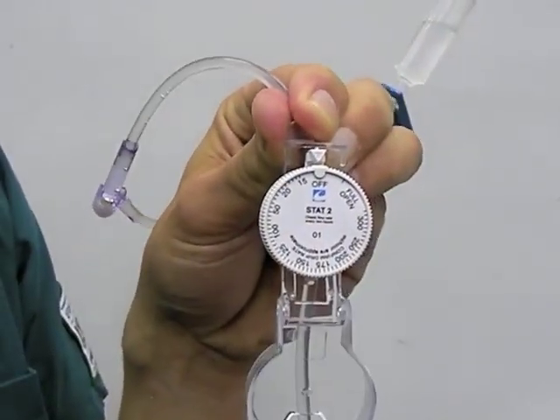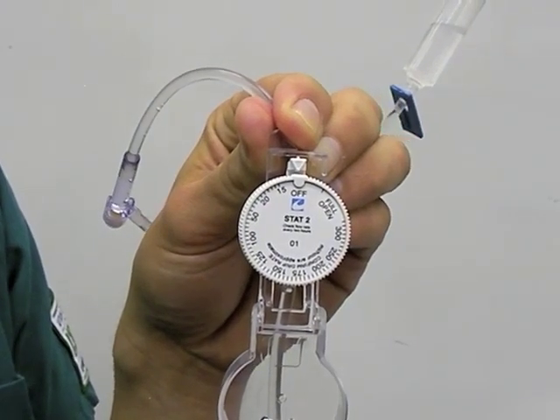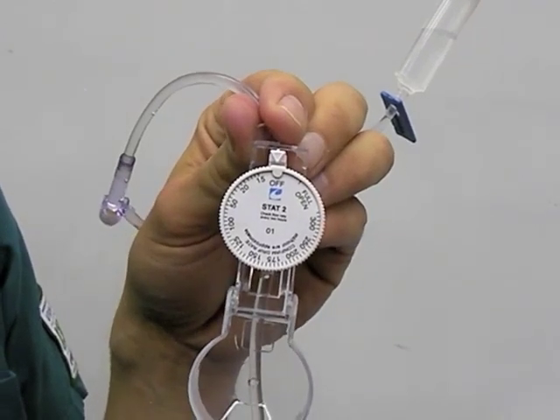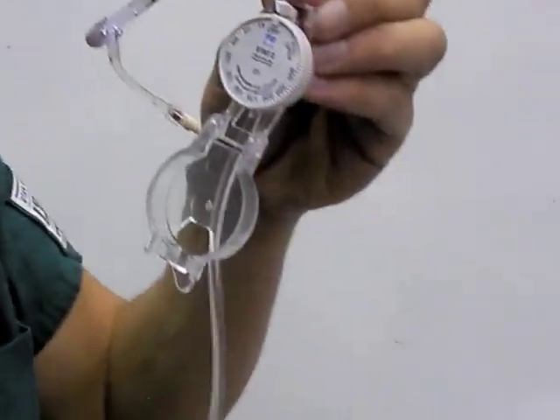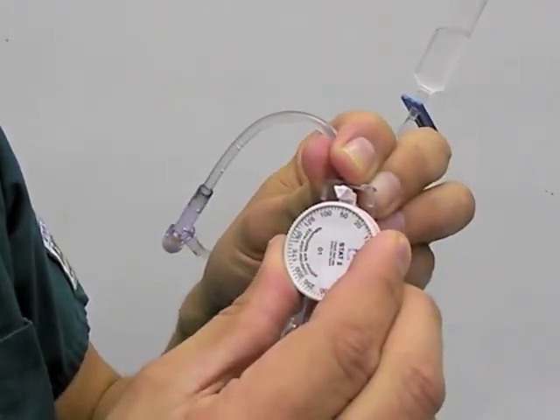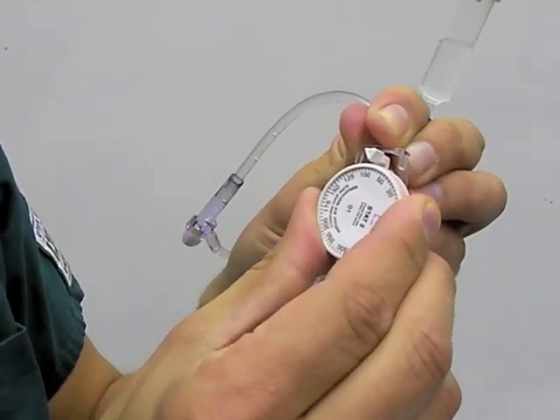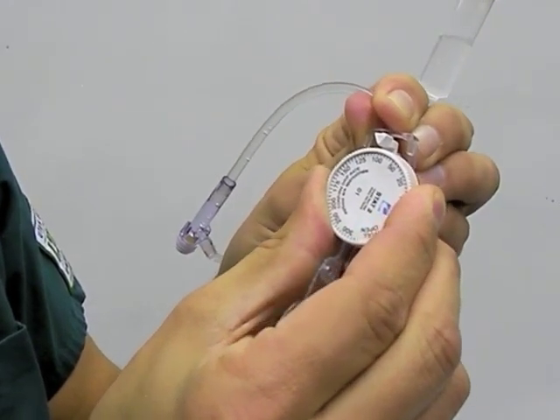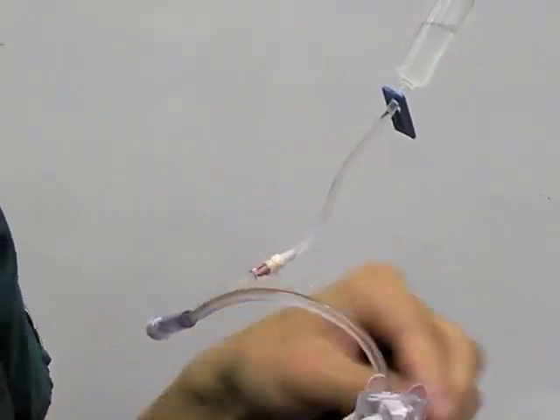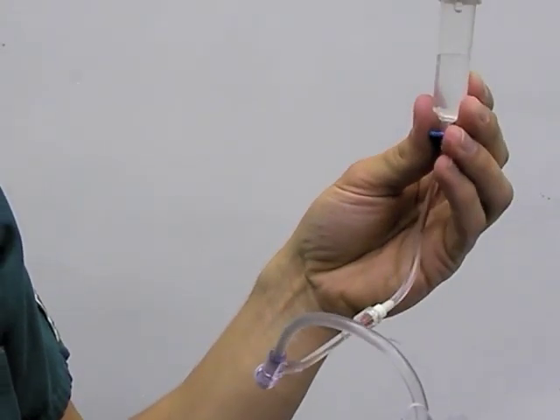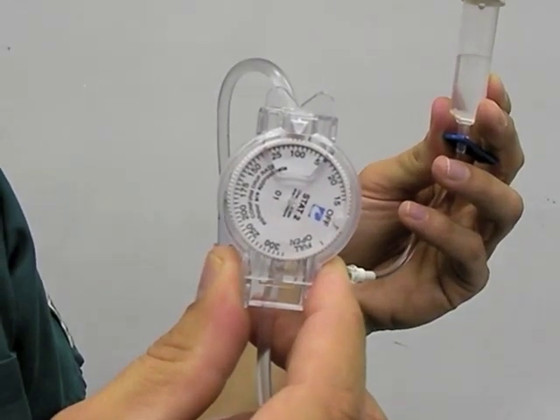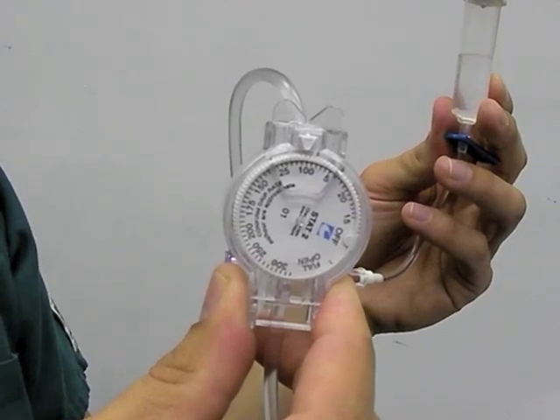Now that we have our administration set connected to both the solution bag and patient, we can start our infusion and set our drip rate. In this case, we will be setting our drip rate to 100 milliliters per hour. Once we set our drip rate, we will want to manually confirm it by counting our drops per minute in the drip chamber. 100 milliliters per hour with a drop factor of 15 drops per milliliter should be 25 drops per minute.